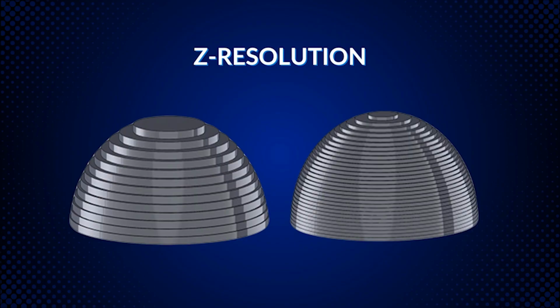There are other examples out there of different resins. We have a Vari tray for custom trays that you can actually print at 500 microns. Now you can imagine the cone on the left being 5 times the step, but that works really well for impression retention. And it's not anything that's being used for critical areas, so to speak. It's just a foundation for your impression material.